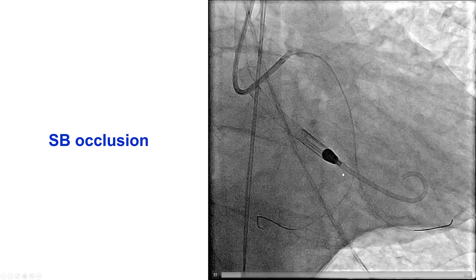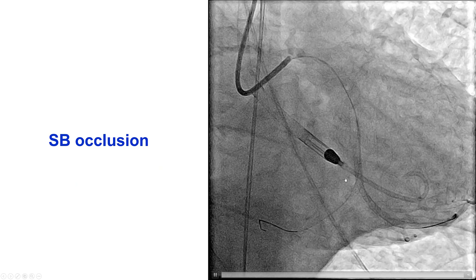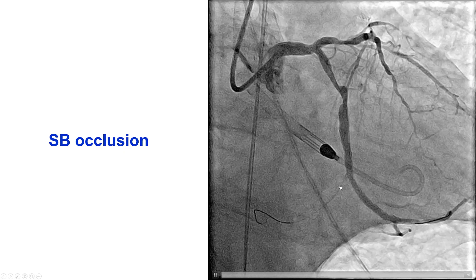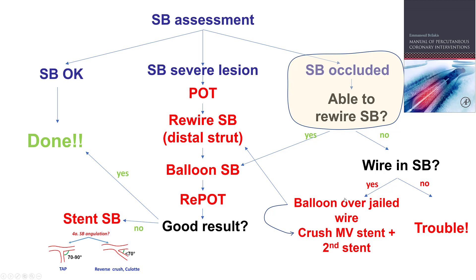The stent was deployed, and as we feared, unfortunately we did lose the side branch. But we did have a guidewire into the side branch indicating the location of the vessel. This is a case of a provisional in which the side branch becomes occluded after stenting the main vessel. The next step is to rewire the side branch, and if we can, perform a balloon inflation — and if that is good, then we're done.